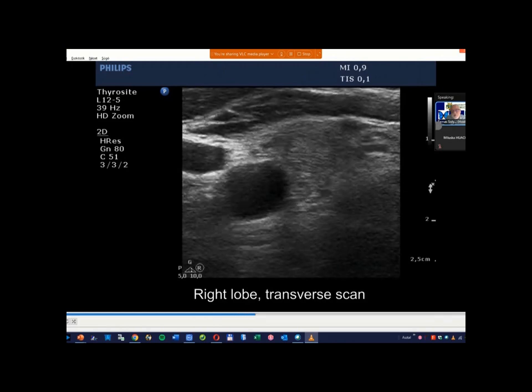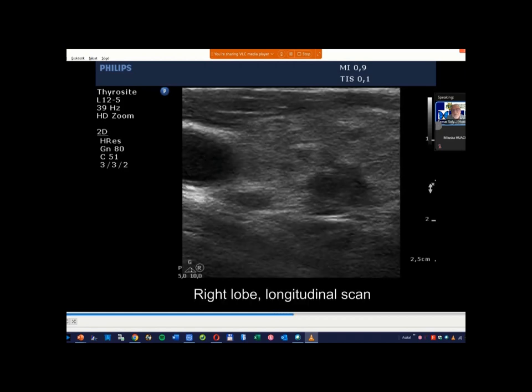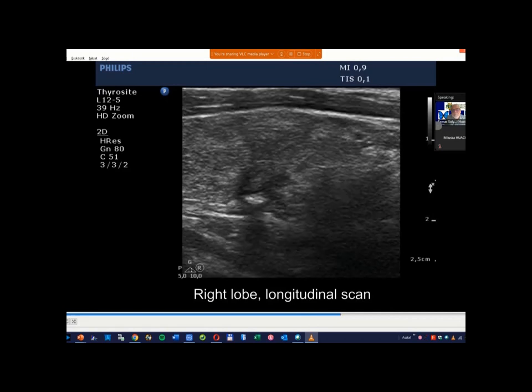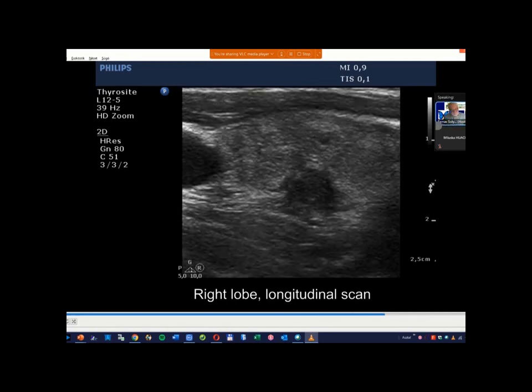I don't think that this is the real issue in this case. Maybe it can. Has, for example, there an echogenic line, but we have to focus on this part, on the ventral part of the lesion. Yes, I wondered that. Okay. Thank you. Other questions or comments?